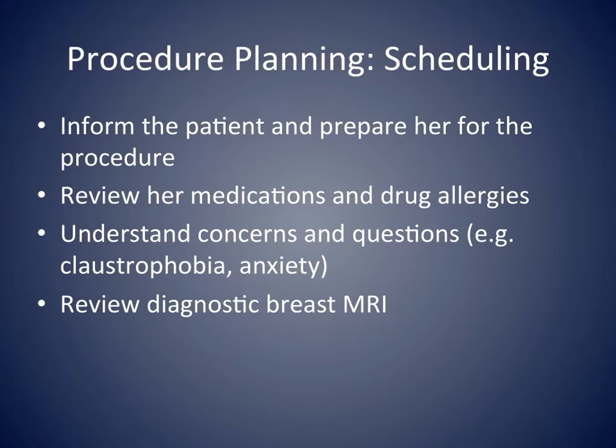A procedure is successful when it's well planned ahead of time. Planning begins at scheduling. This is the time when we give the patient preliminary information about the biopsy to prepare for the procedure. It's also when we review her medications and drug allergies and become aware of any concerns or questions the patient may have. It is also when the diagnostic breast MRI is reviewed by the radiologist scheduled to perform the procedure to ensure that the lesion has been fully worked up and the biopsy is indicated and necessary.